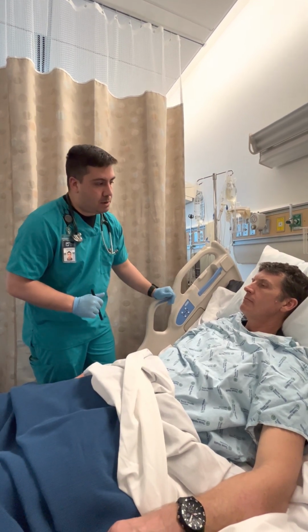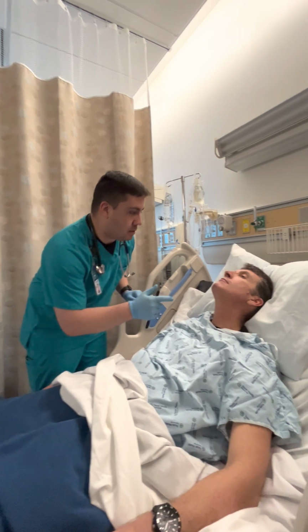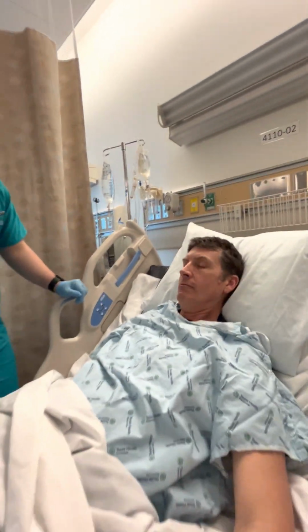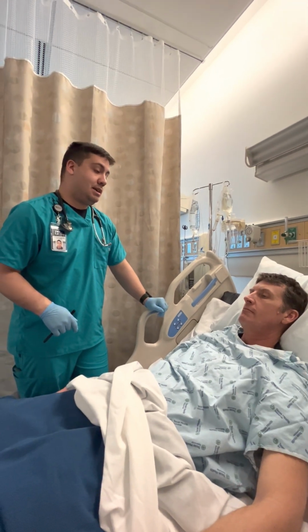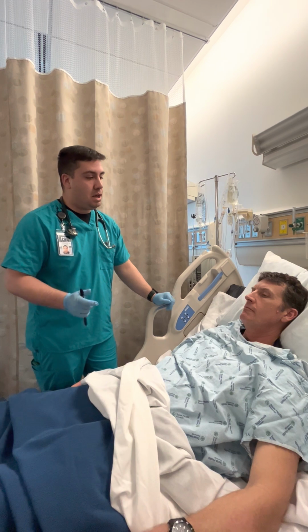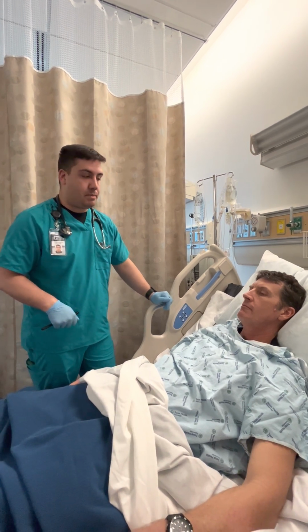Are you able to tilt your head back for me, please, sir? Thank you. So I'm going to visually take a look in there. I'm going to shine a light. The mucosa looks to be pink. I don't see any skin damage, lesions, polyps evident. I see no drainage at this time from my patient's nose.